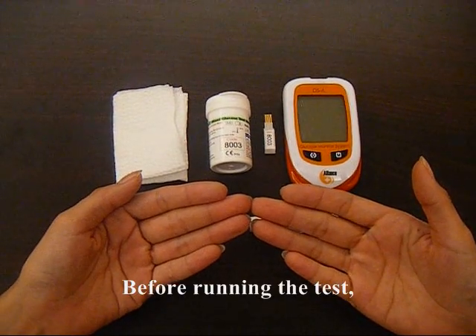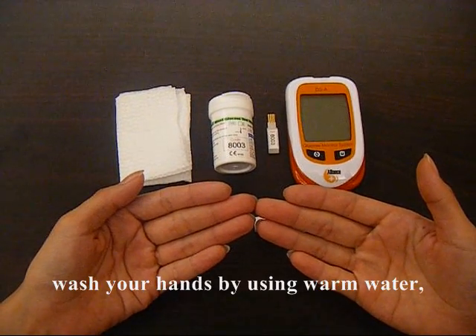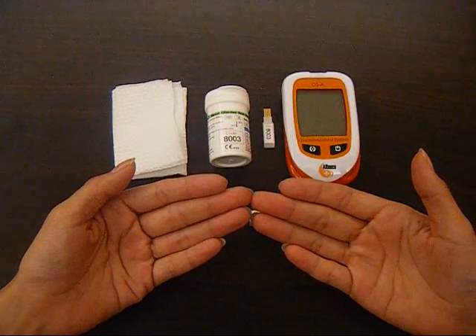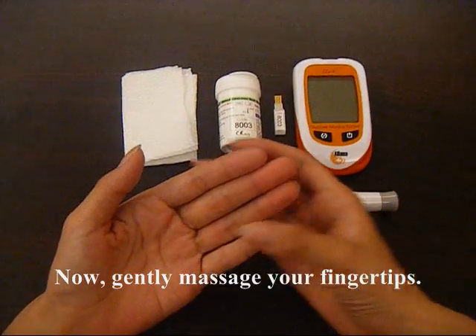Before running a test, wash your hands by using warm water and make sure your hands are dry enough. Now, gently massage your fingertip.